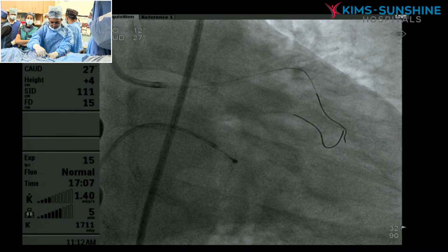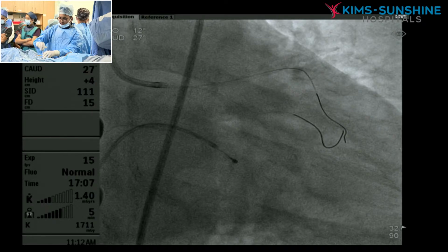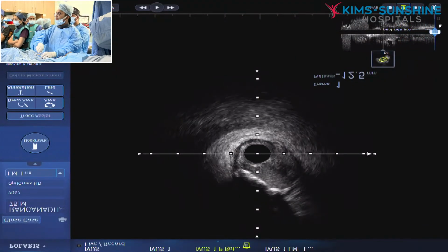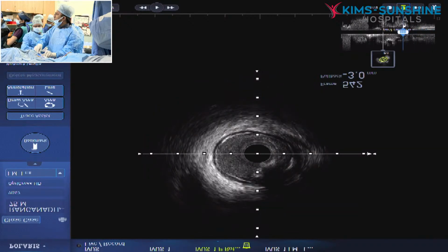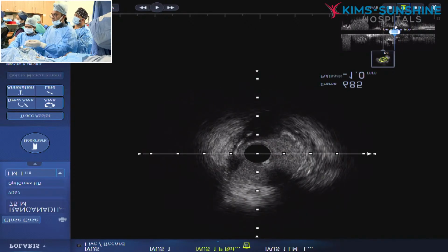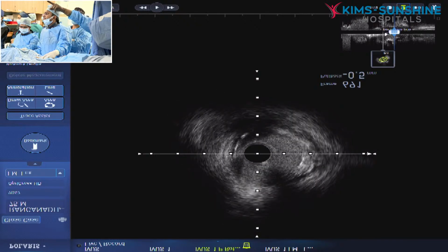Once show me the L6, brother. Distal I want areas. Go to distal. Still. Come back. That's all fine areas. Come back. I asked him. What happened? That IVUS run angio, show me. Brother, show me the IVUS run angio.